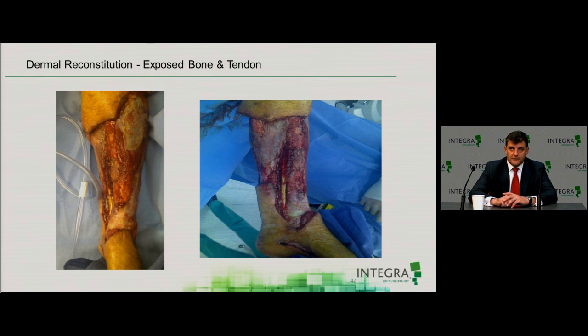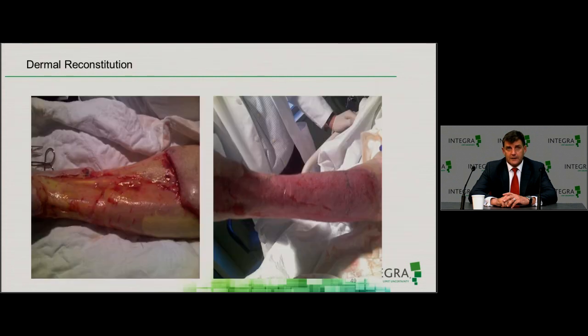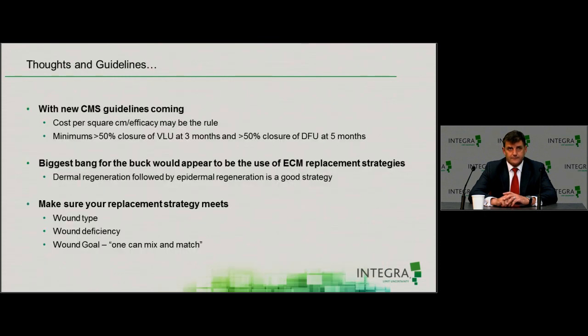They'd had all their skin cut away to make sure we had viable margins, taken back to the operating room, and then we went ahead and placed IDRT therapy with pie-crusted negative pressure wound therapy. Then at day 21, we took all the silicone off, and you can see some of the staples still in the skin graft on the right-hand side. That's still at post-op day 4 from the skin graft over that.